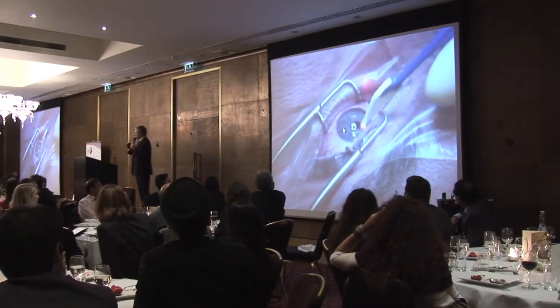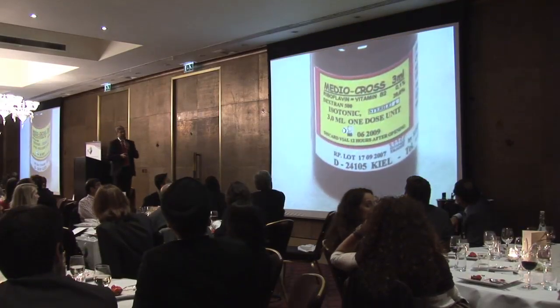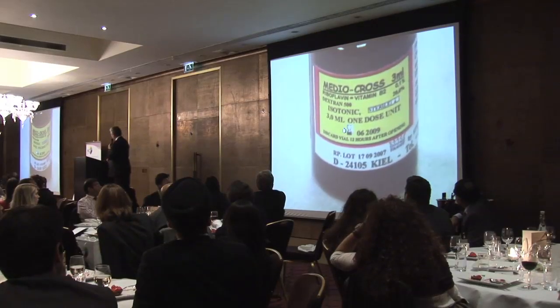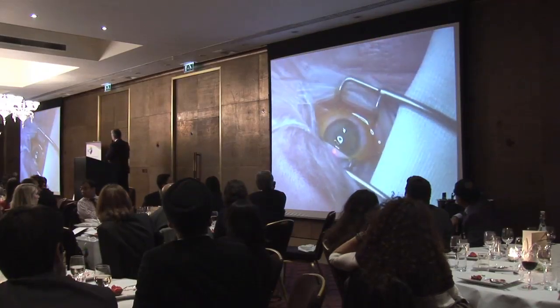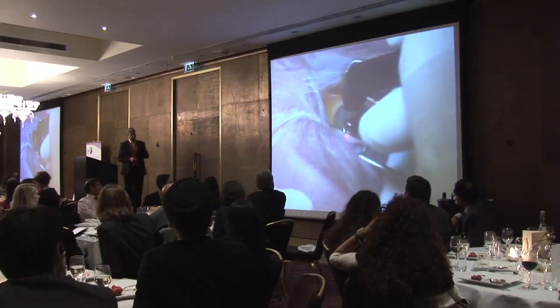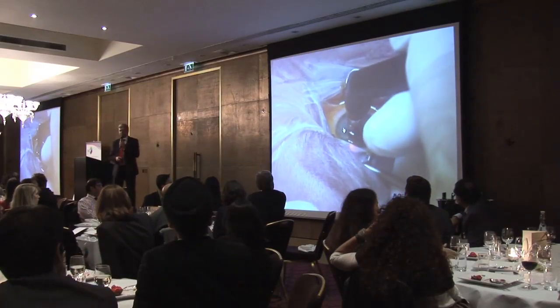We should be sure that the cornea is actually really full of riboflavin. So this is a solution of riboflavin, and after roughly 30 minutes, the cornea is ready. We are measuring the corneal thickness with pachymetry.